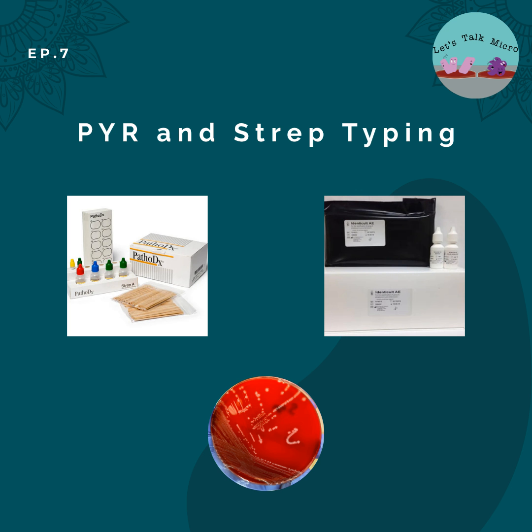But that's what you use PYR for. So you have a positive, depending on the hemolysis, you have Streptococcus pyogenes, or you can have Enterococcus. There's another test that we use for beta hemolytic strep, which is the strep typing. Have you heard about this? Before we get there, I mentioned that the PYR positive reaction is a pink color, and no color development is a negative result.